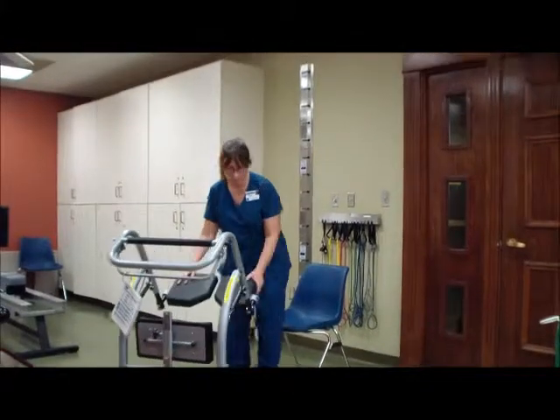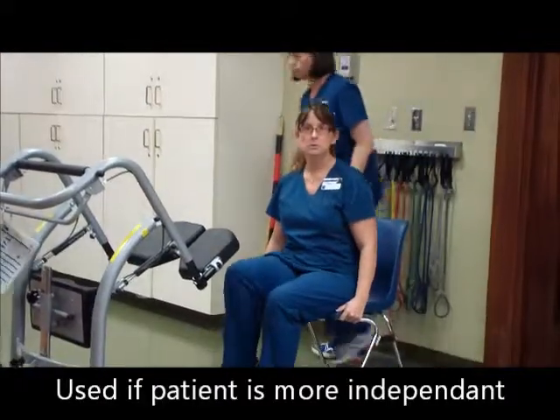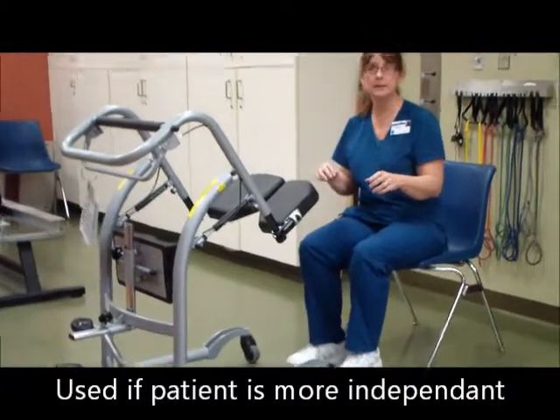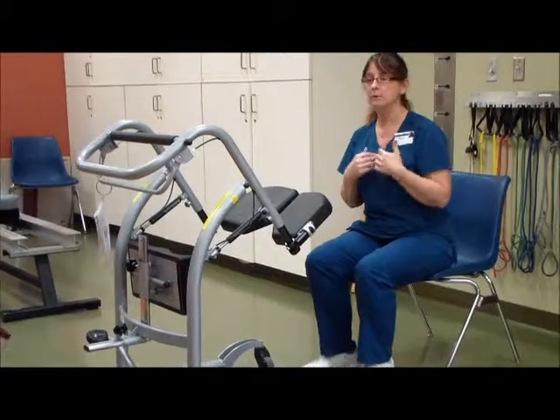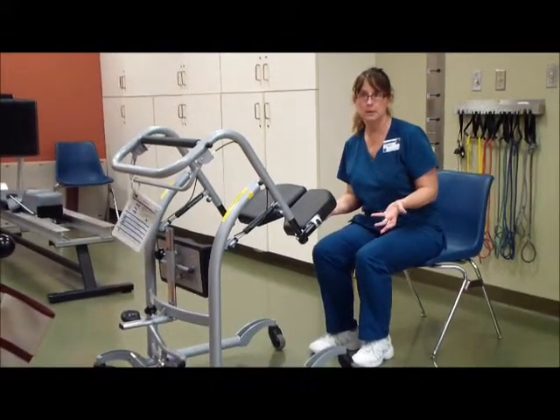They need to be able to do their own, like if they're sitting, they need to be able to march. They might need a little help, but they can work on coming up. This is for the nurses basically to use, but we may still use it with them. If we're using it with them, we may still put a gait belt on them, but the nurses don't normally put a gait belt on.